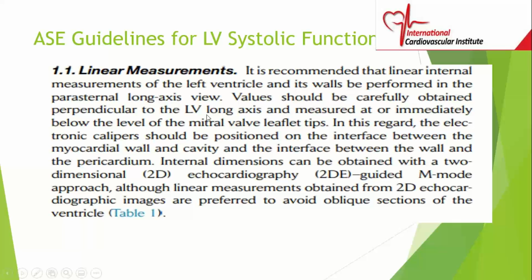The values should be carefully obtained perpendicular to the LV long axis. These are not arbitrary measurements. I'll show you what they mean by the LV long axis, and your measurement should be perpendicular to that.